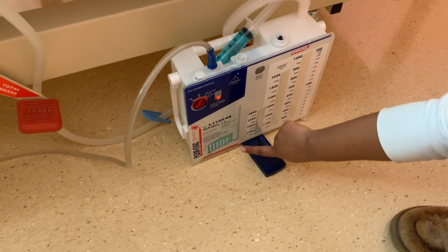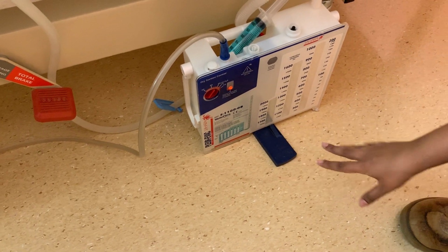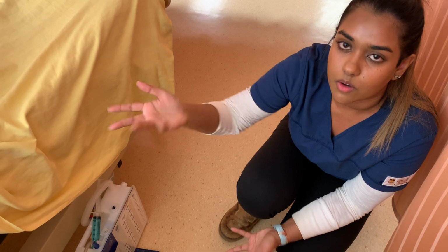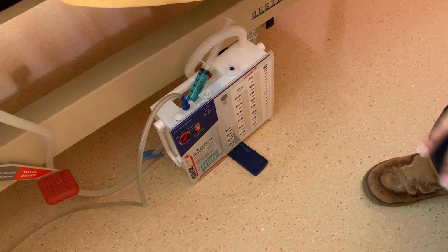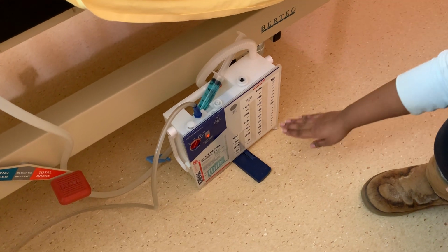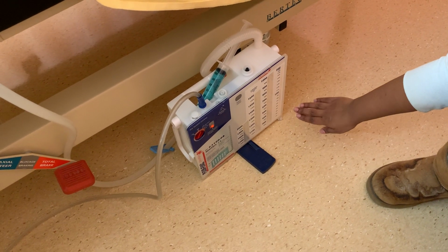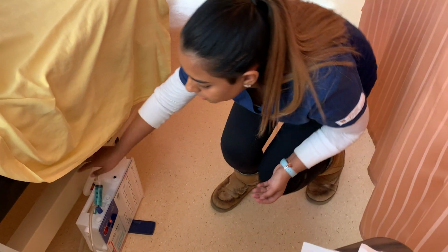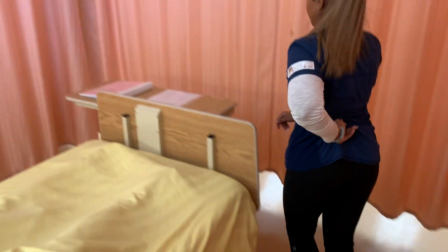There is a correct amount of fluid here, and there's no Jacuzzi bubbles. If there were large bubbles, I would get another nurse and we would assess for the leak, because that would indicate an air leak. We can see tidaling, and that's what we want to see as the patient inhales and exhales. I'm going to look at the drainage, and I'm just going to mark it at the beginning of my shift with a marker, just so you know.